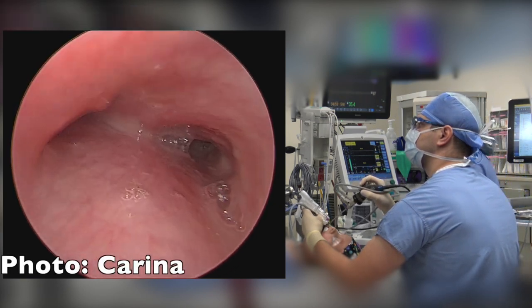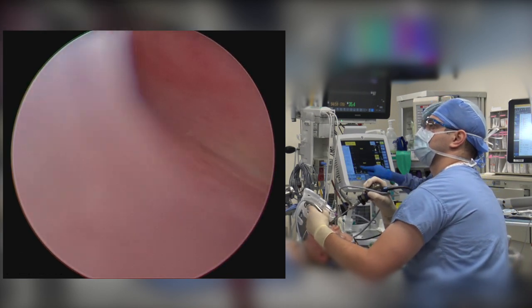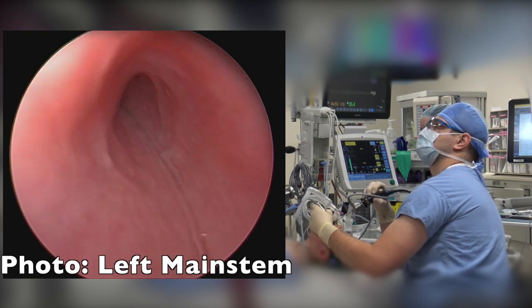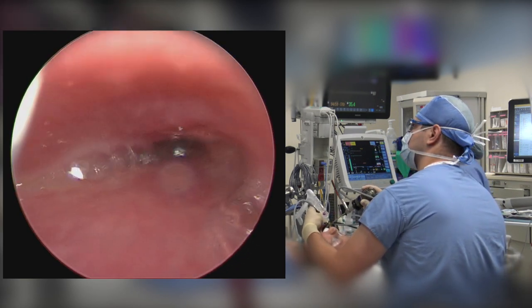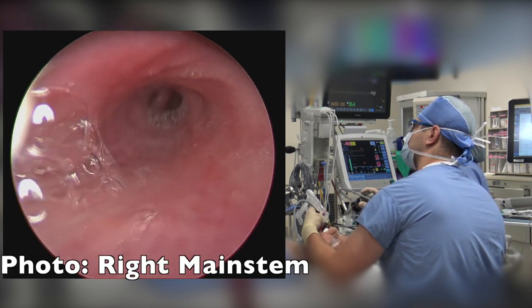When the carina is visualized, the head of the patient is turned to the right and the camera is turned counterclockwise to examine the left main bronchus. Then the head is turned to the left and the camera is turned clockwise to examine the right main bronchus.